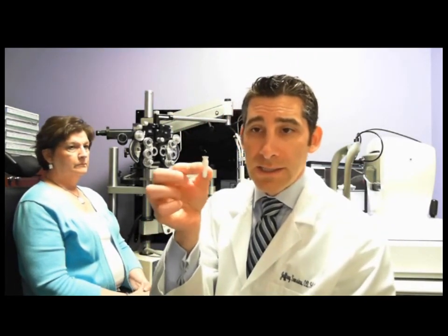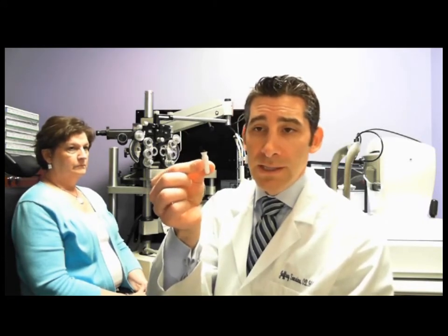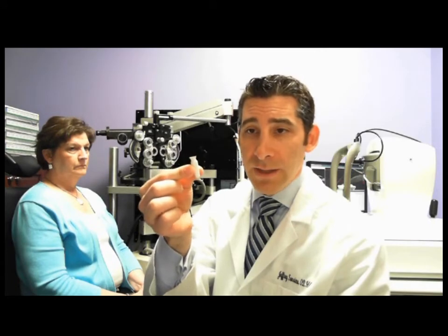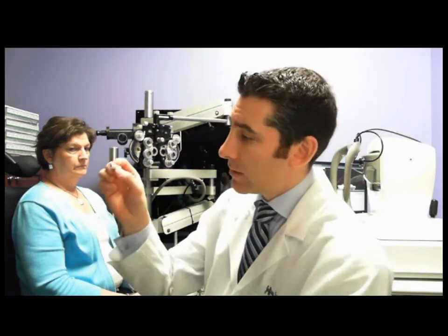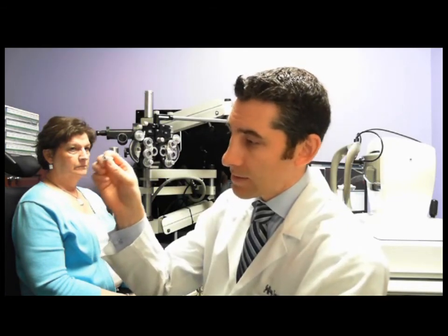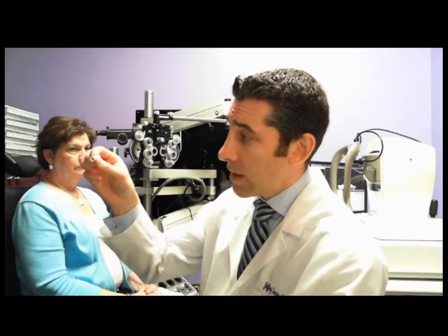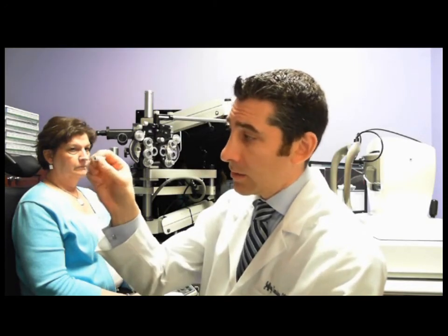So now we're ready to remove the lenses. In order to remove the lenses, you're going to need a scleral remover. And so these are closed on the bottom, so they actually will create suction. In order to remove the lens, I want to oppose the suction device to the center of the lens, and the goal is to break the suction. So I'll kind of tilt it up and down, left and right, until we can break that suction. Once you break the suction, the lens will come right off. Let's give that a shot now.